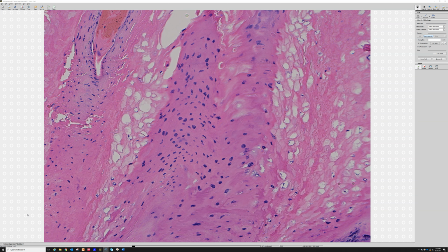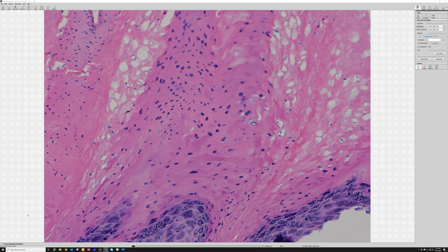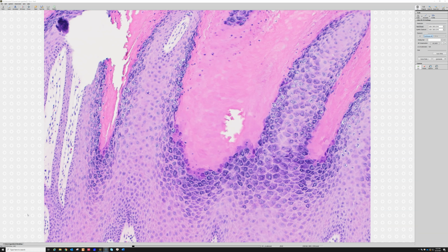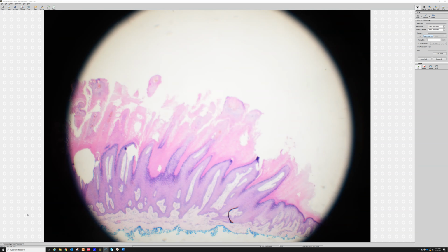But anyway, that does happen sometimes where you get this large parakeratosis, and occasionally I've seen times where HPV-driven squamous cell carcinomas, like in the vulva, have this large atypical looking parakeratosis, but I've also seen that plenty of times in regular old verruca vulgaris. So in a site like the anogenital area, I might be cautious if I saw that and couldn't see the whole lesion underneath, but otherwise it doesn't bother me if I see what otherwise looks like a perfect wart. And again with the hemorrhage and the spires of parakeratosis.